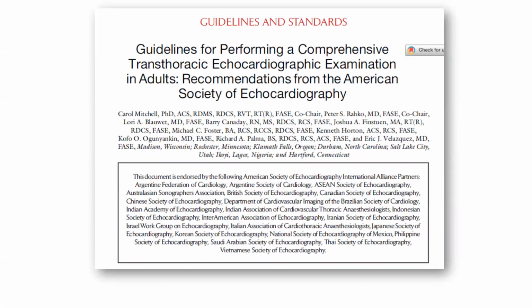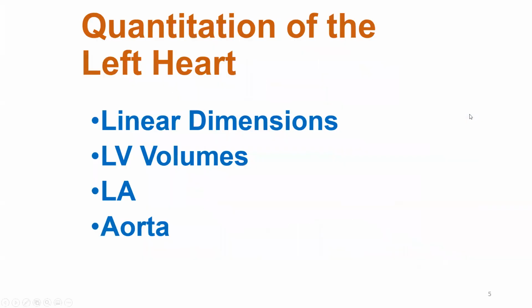If time is short in your preparation for the boards, I would recommend that you look at both documents, look at the images in particular and the tables, because I would be surprised if you are not tested heavily on the data in both of these documents. So let's get into this.